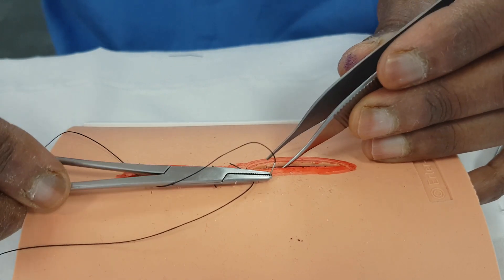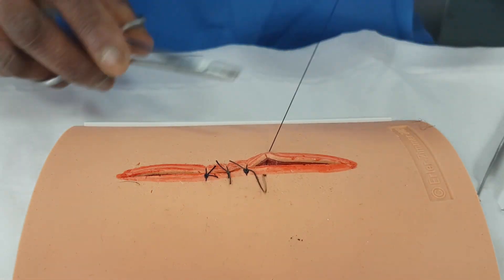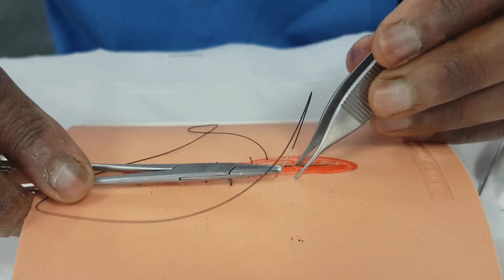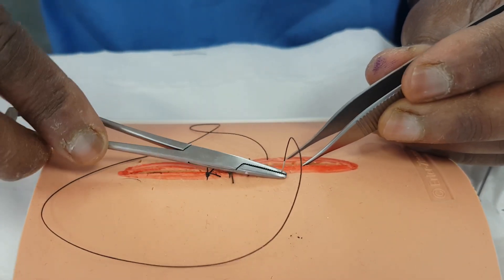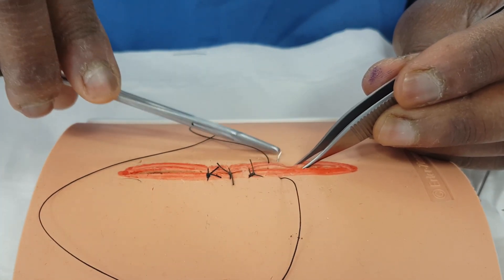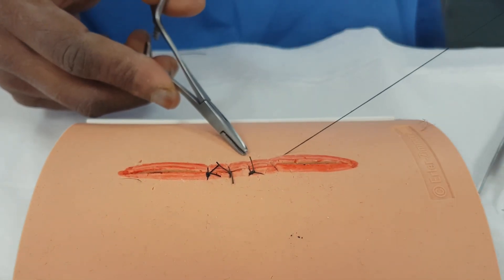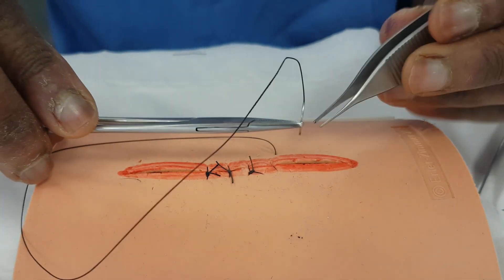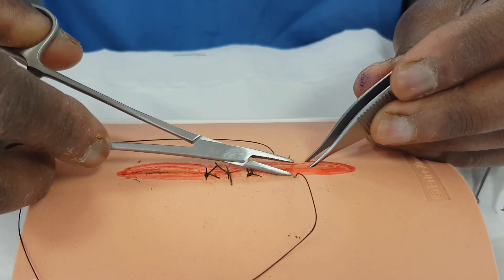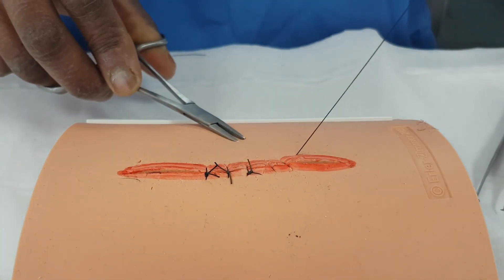So you make your incision, you make your circle just as we did before, bring that through, pass it. You start mounting the needle holder again, and you make your next one the same distance apart, again doing it with a continuous curve of my wrist. It's a slightly small needle for this wound and I'd normally use a bigger one. But you'll see that it will now lie at an angle. My next stitch should end up being exactly parallel to that first, because all I'm doing is focusing on being straight in my wound. We'll do one more for good luck.